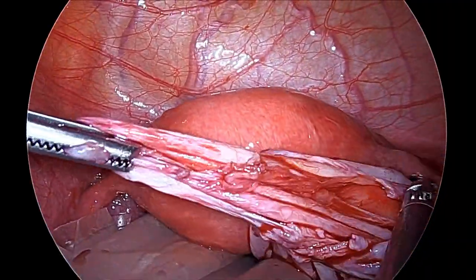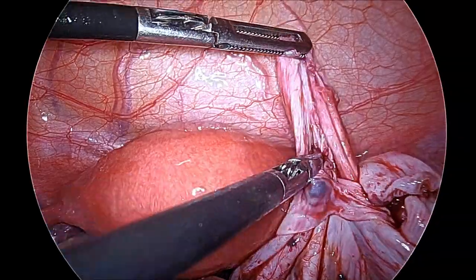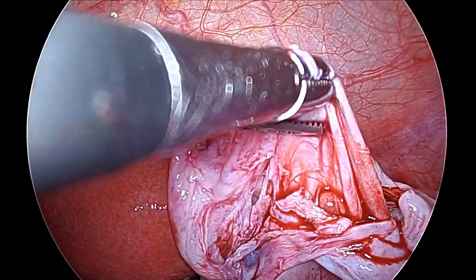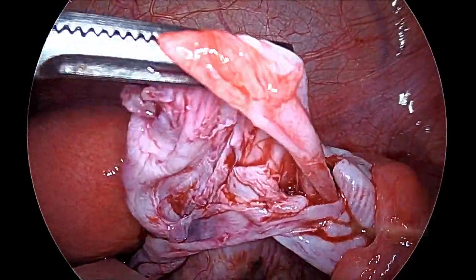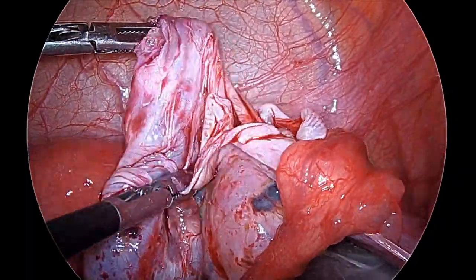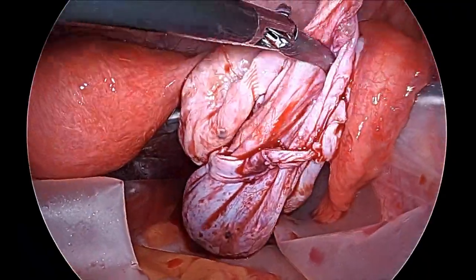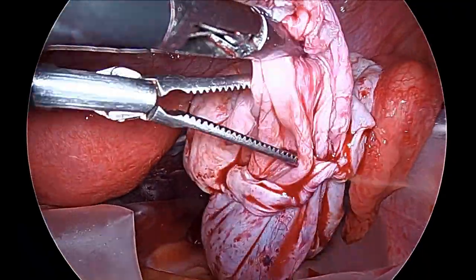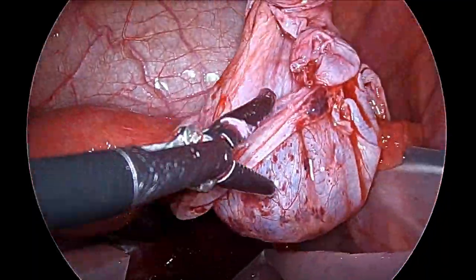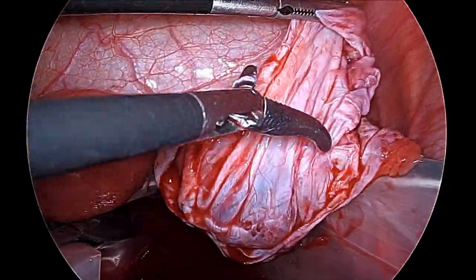We can see this side is good and plain, and the cyst is coming out easily. Sometimes you can wrap the cystic wall over the grasper to optimize traction and facilitate the easiest stripping. The cyst is almost out — you have to walk along the cystic wall and slowly, equally separate it all around.